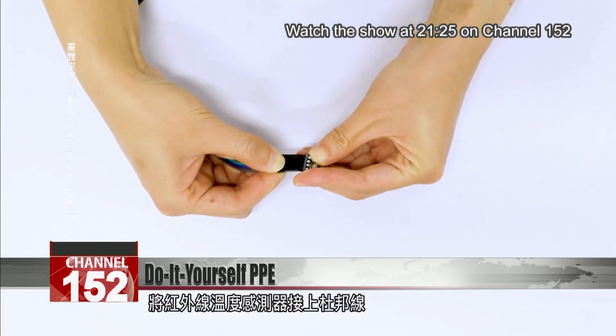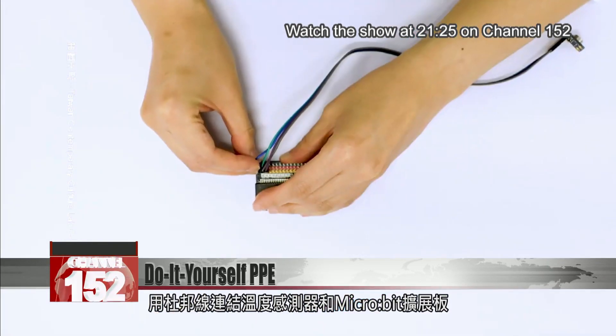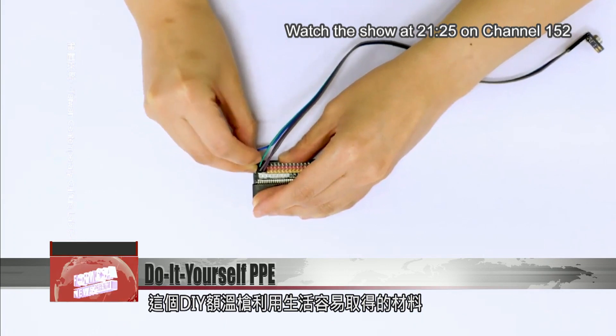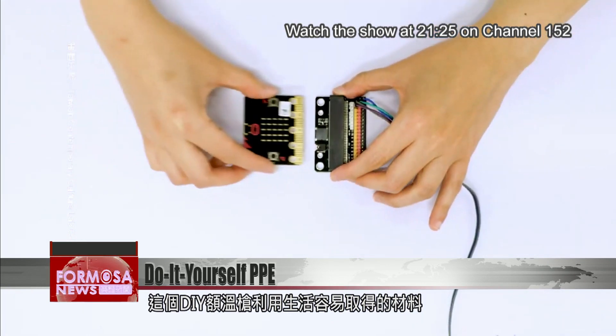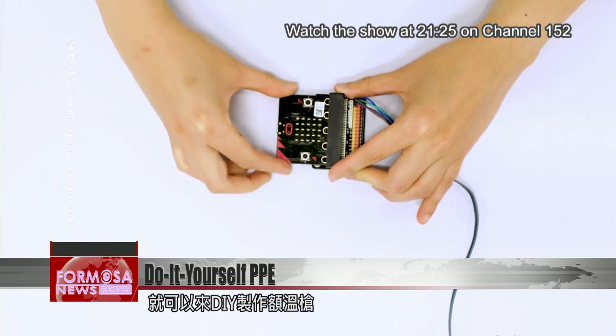Connect the infrared sensor module to the jump wire, then use the jump wire to join the module with a microbit docking station. This DIY thermometer can be made with everyday materials and a microchip technology that elementary and junior high school students use in their classes.